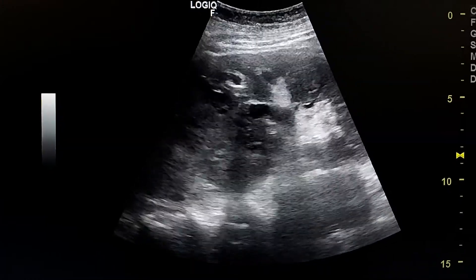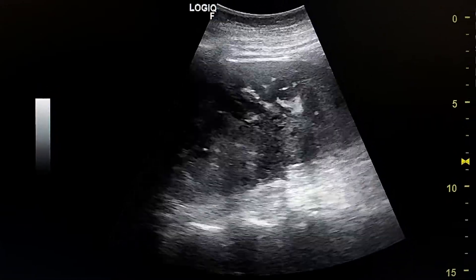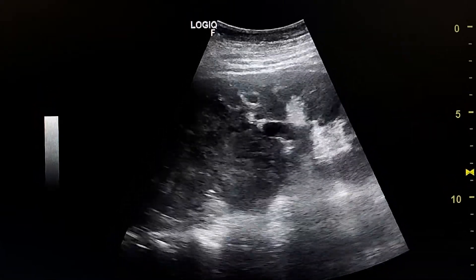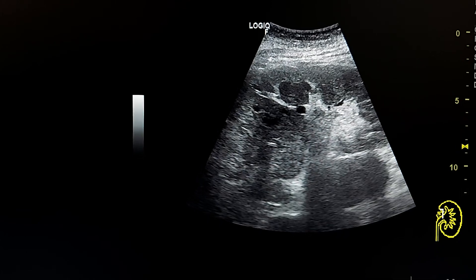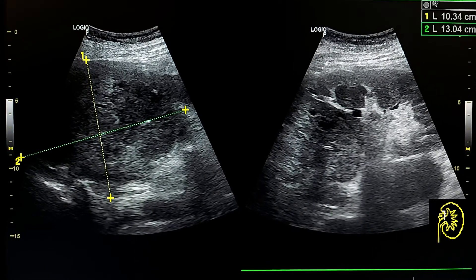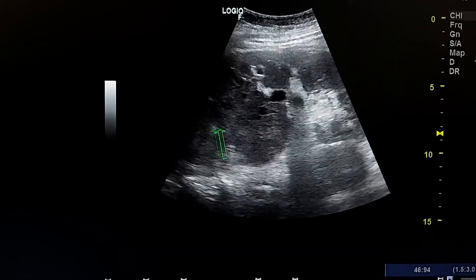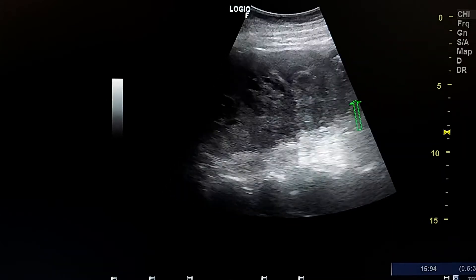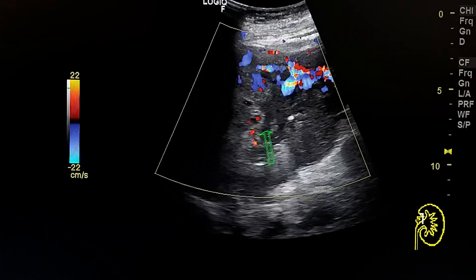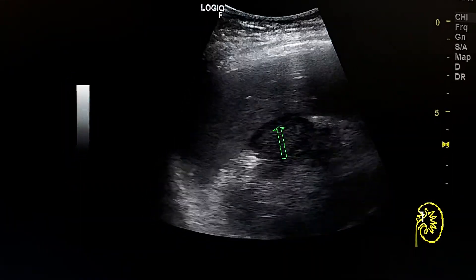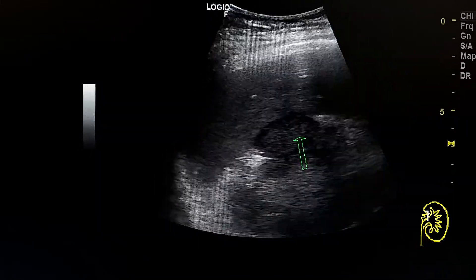This is a large left kidney mass in a 70-year-old woman. It measures about 13 centimeters. This is the mass and this is the lower pole of the left kidney. It has internal vascularity by color Doppler. Here we see the margins between the spleen and the mass.